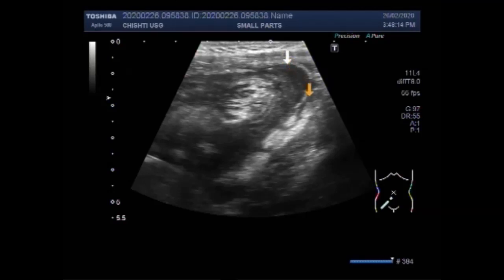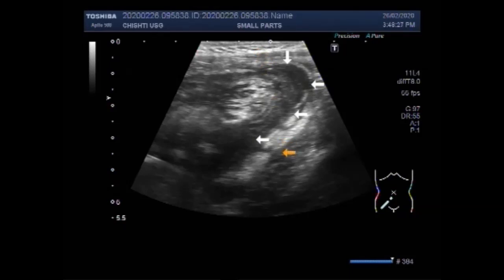This is the fluid seen in the right iliac fossa along the gut loops.